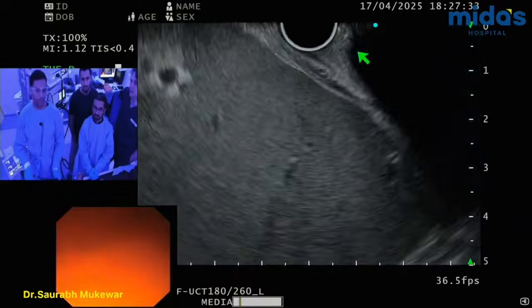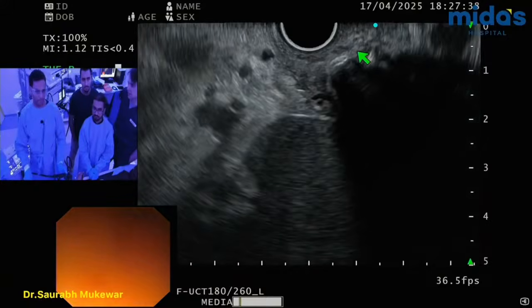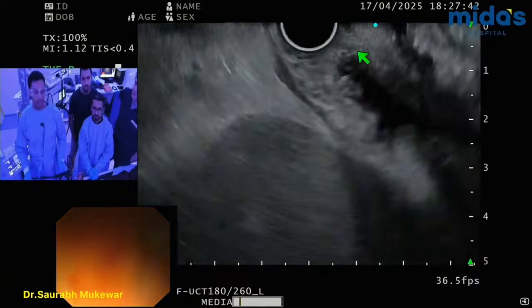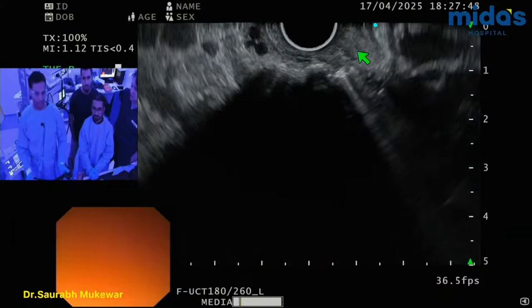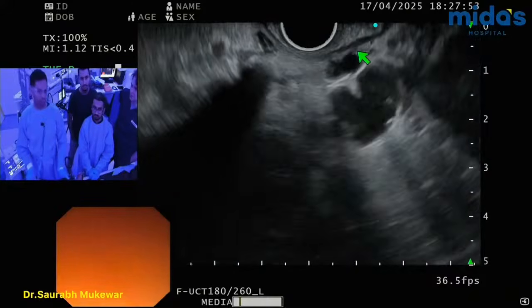In an acute situation when there is a bleeding, it's impossible to do this. When it's bleeding in front of your eyes, you can't spend time figuring out the inflow and the outflow. Then you don't have time for it. Then you just put the needle in the varix, and then just put the glue, right?